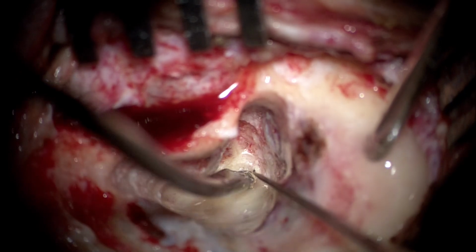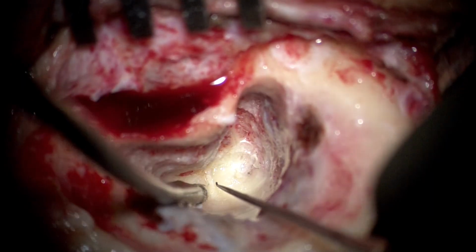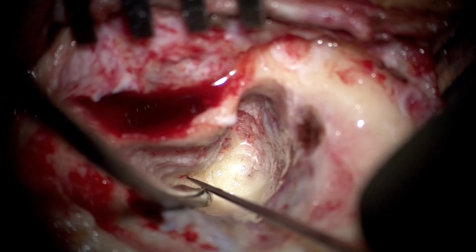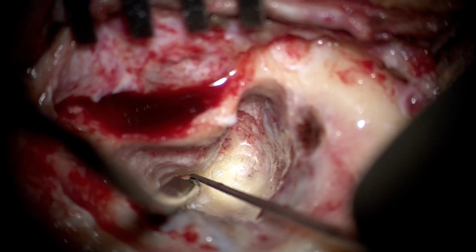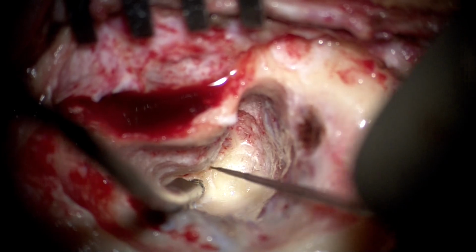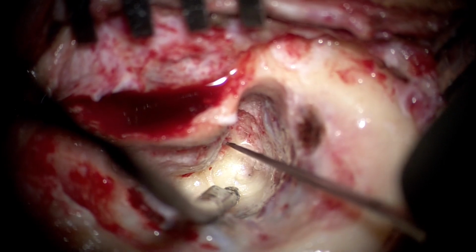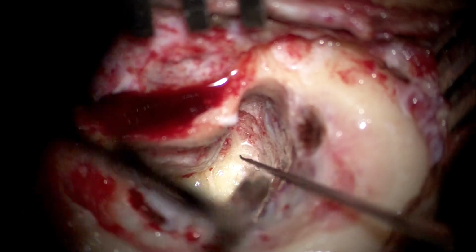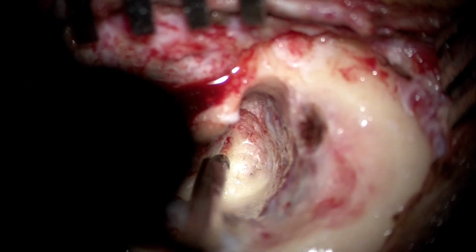This is the erstwhile endolymphatic duct or the vestibular aqueduct, which you can see coming posteriorly from the vestibule towards the posterior fossa very, very clearly. This is the vestibule now, the inferior most aspect of the vestibule. This is the superior aspect of the vestibule. We are clearing some of the epithelium using a bent pick or a needle.